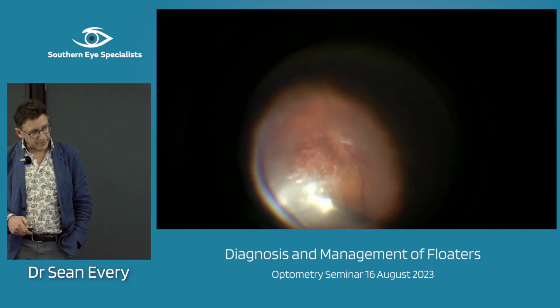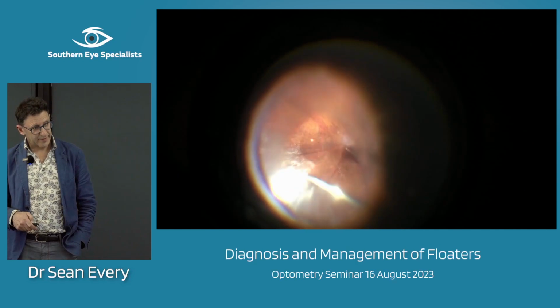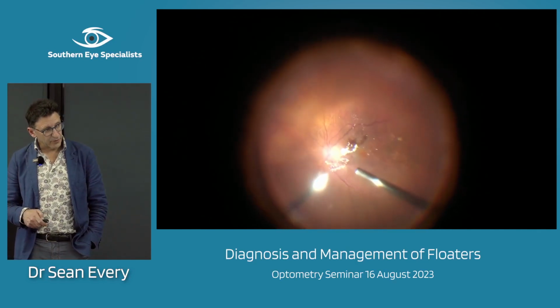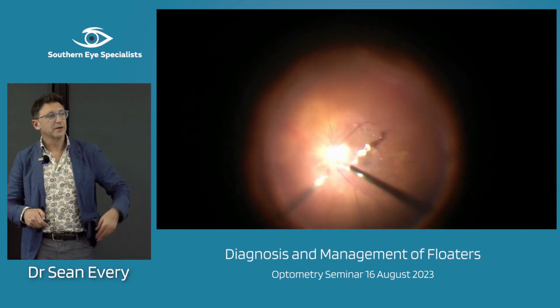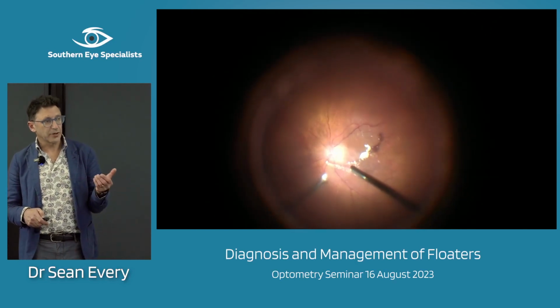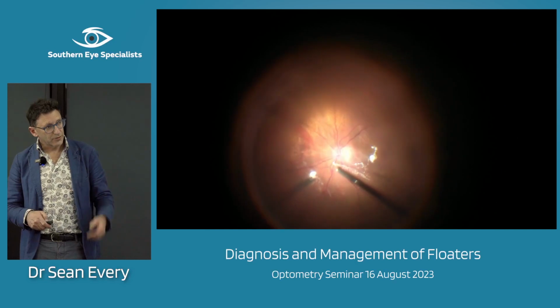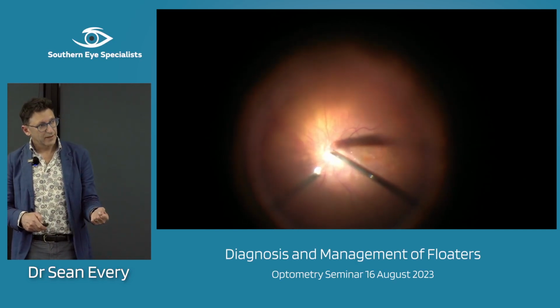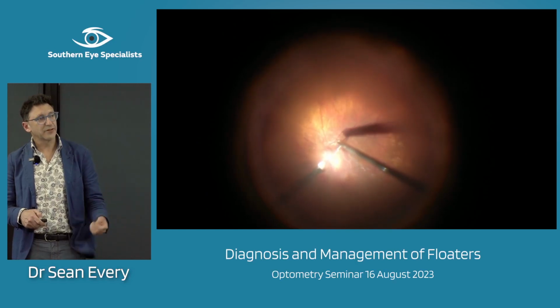Yeah, so there's a little cutter, a little guillotine cutter down the end here, 10,000 cuts per minute. Vacuum's probably about... So here you can see the posterior hyaloid. So you can see the asteroid staining the posterior hyaloid in a sense. So what I'm going to be doing now, see, I've gone onto vacuum. See how it sort of leapt in there? And I'm just engaged.